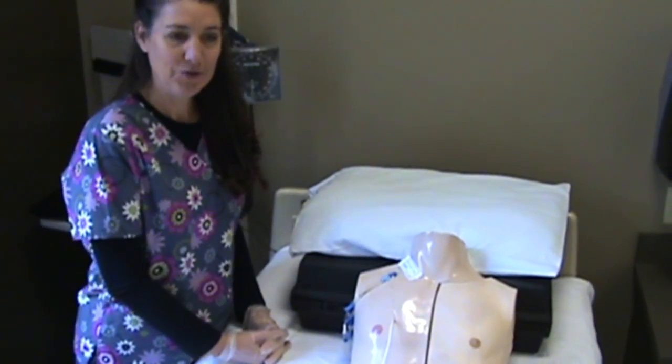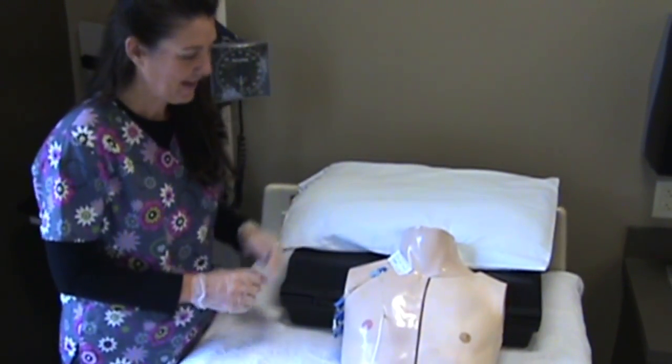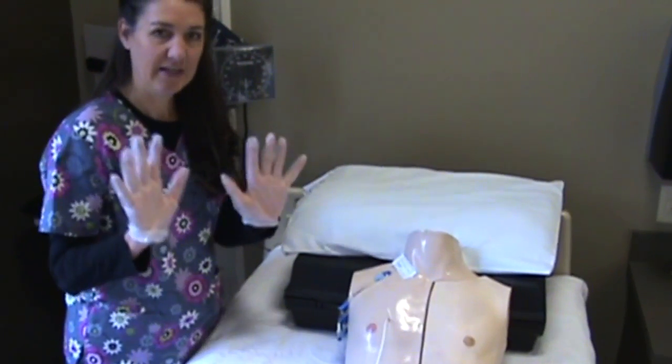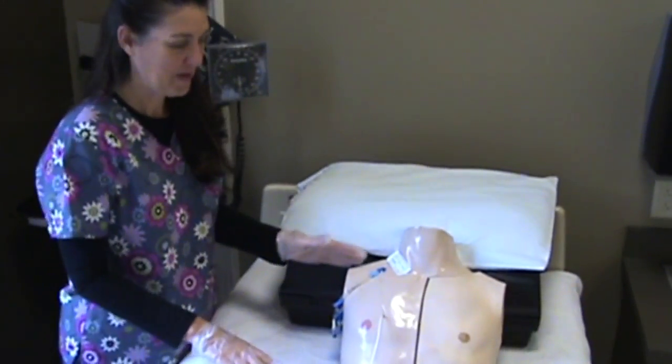Hello, I'm going to explain to you about a CVC dressing change and this is my mannequin here. To change it, I'll need clean gloves and a kit and of course a patient.